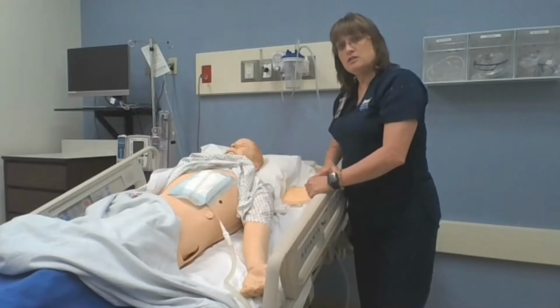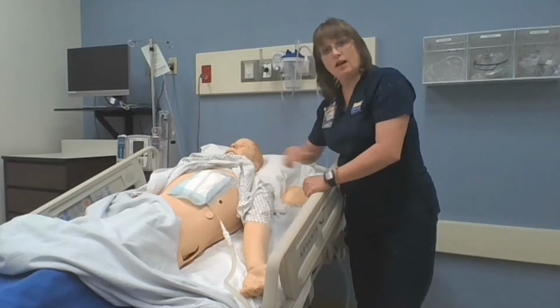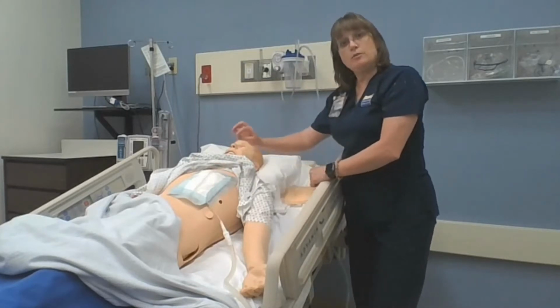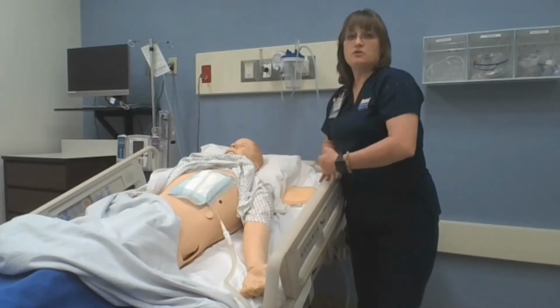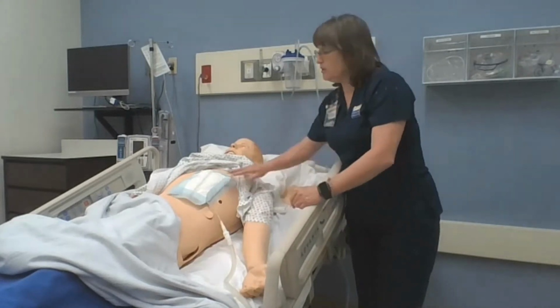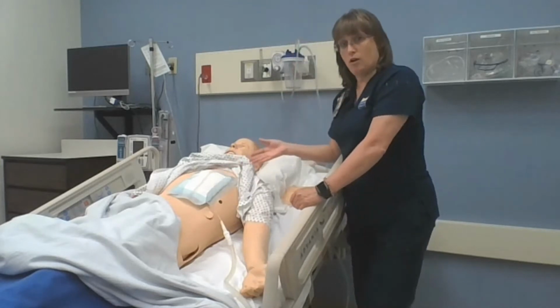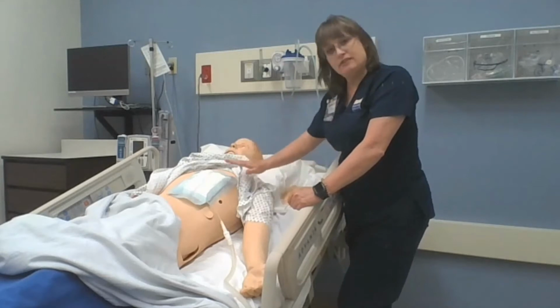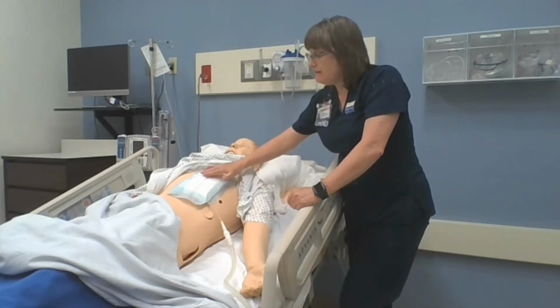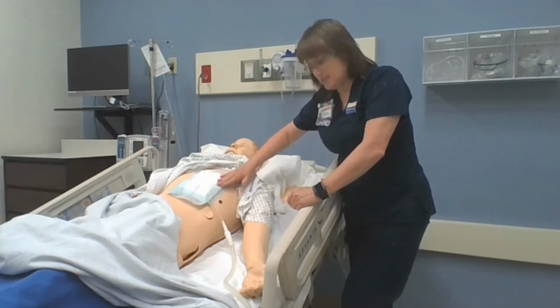The next thing I'm looking for is, is there any kind of drainage? If there is drainage, I'm going to take a Sharpie and I'm going to outline exactly how that drainage is. And then I'm going to put the date and the time so that if somebody who's coming in on the next shift can look at it and go, oh yeah, okay, that's about the same amount of drainage, or did it grow? So after I've looked at it, now I'm going to feel it. So I'm palpating lightly and I'm feeling for any subcutaneous emphysema.